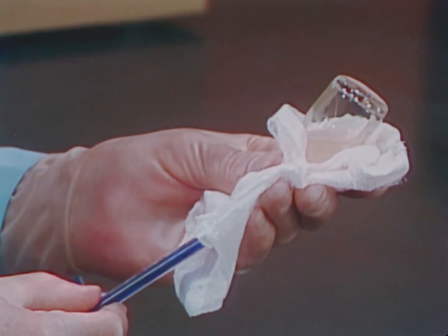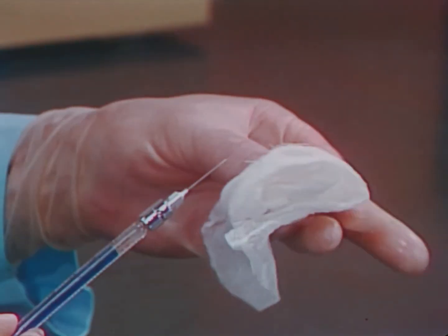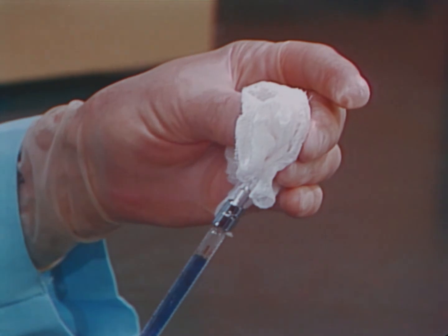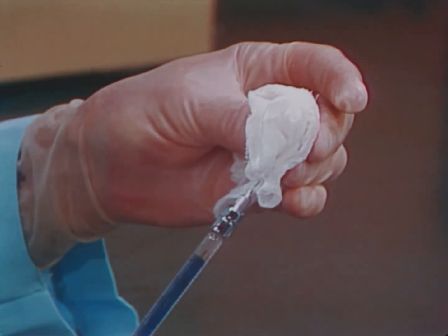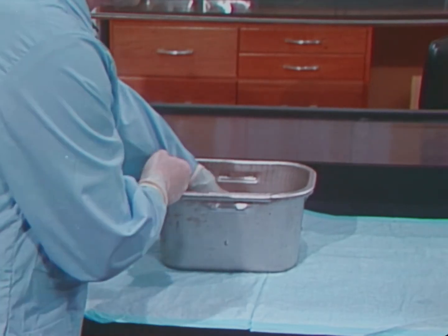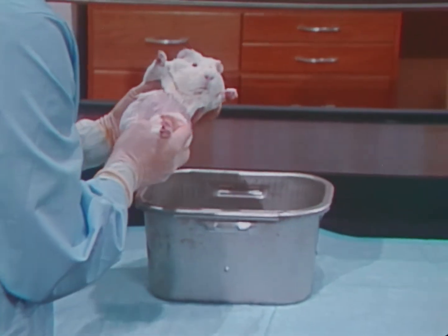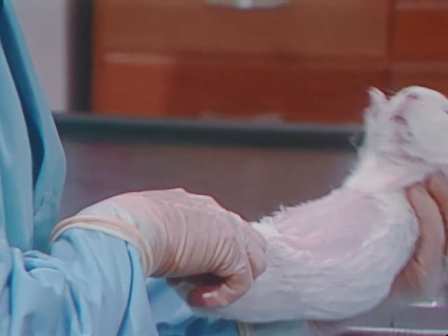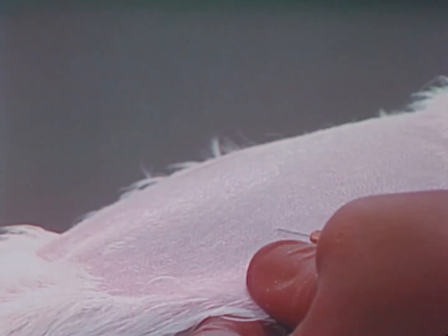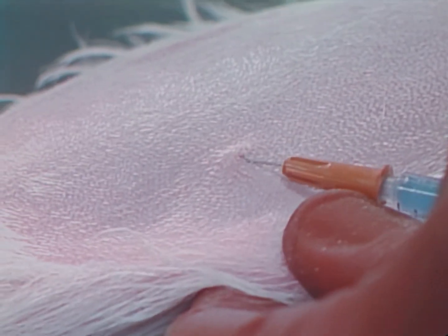Expelling air from a partially filled syringe also creates an aerosol. This procedure should be done only when the needle is covered with alcohol-soaked gauze. Some laboratory procedures require handling and injection of experimental animals. Laboratory animals should always be handled by trained personnel. Animals must be properly restrained during inoculation.